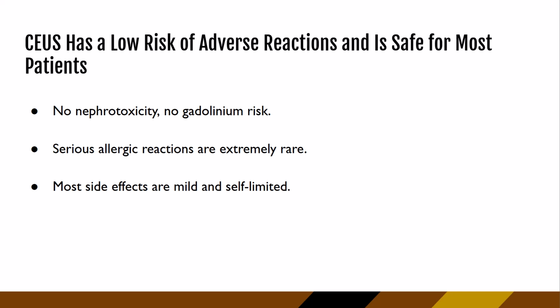We also talked earlier about how safety is such a major advantage of the contrast-enhanced ultrasound. Remember that the UCAs don't harm the kidneys, and they really have a very low risk of allergic reaction, way, way lower than the CT or MRI contrast. So there's really not a need then to screen for renal function, which is helpful, and then we know it's also going to be safe for most of our patients. Side effects, usually, again, very mild or self-limiting, might be kind of like a transient nausea, sometimes a headache, but usually those will resolve very quickly as well.